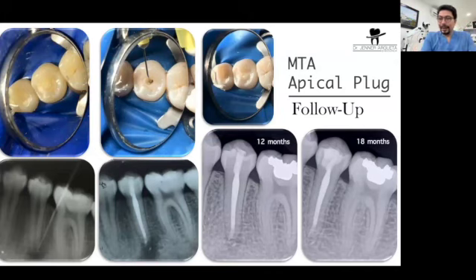But going back to the clinical results, this is a case managed by me. A long time ago, I will say that I performed this treatment maybe 8 years ago. The pictures were taken with an iPhone. They were taken with a cell phone, and as you can see, the pictures are acceptable. You can also notice that by that time we weren't working with digital radiographs. We were still working with the regular radiographs.